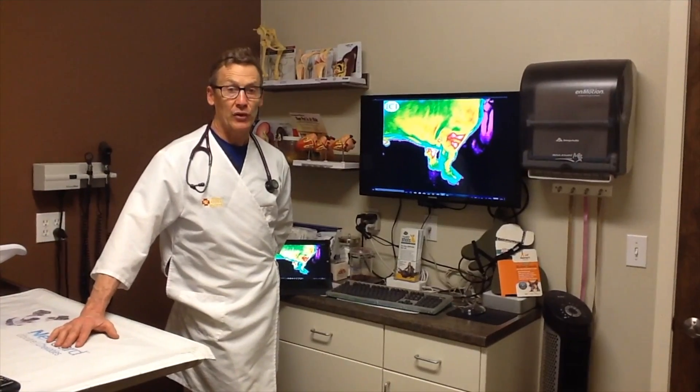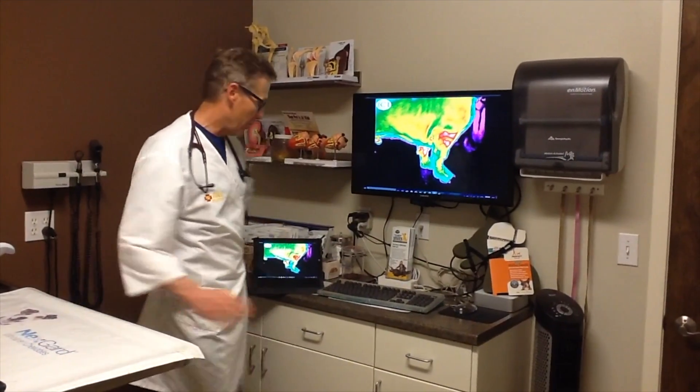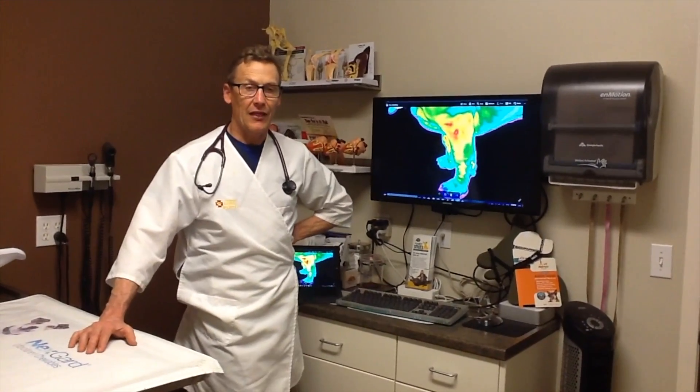The digital camera was really helpful in localizing that. You can see on this image the increased thermal gradient around the right elbow, and then if I switch you over to the left elbow, you can see much less of a thermal gradient on that image.